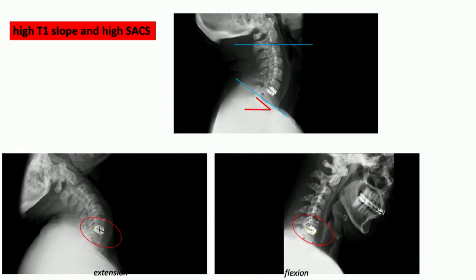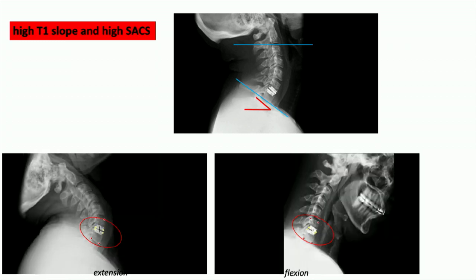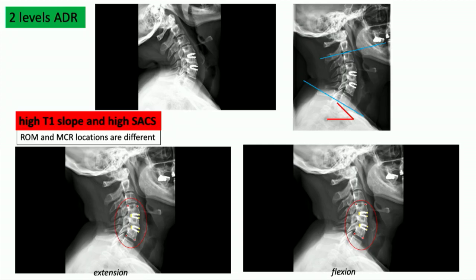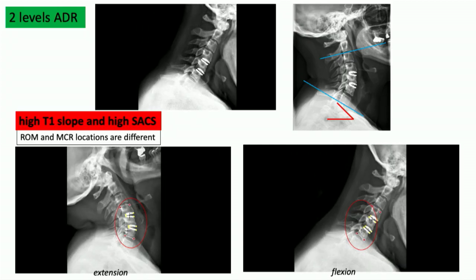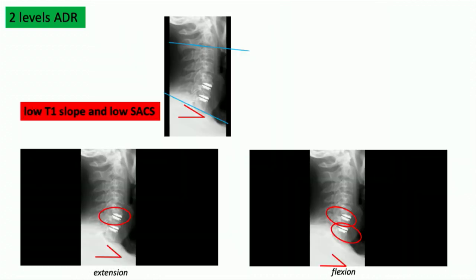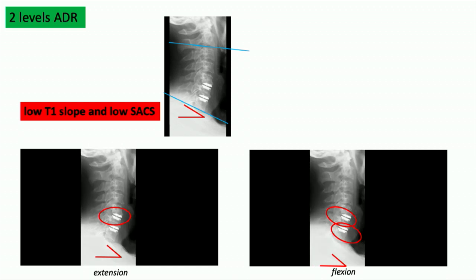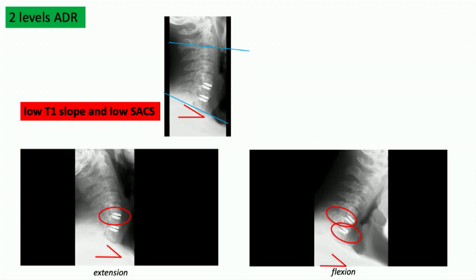Again, another case, you see those patients very often have a tendency to have a kyphotic neutral position with mechanical prosthesis. It's the same with two-level prosthesis. We can have the same thinking. Look at this again, with this type of adaptation between the neutral position, hyperextension, and hyperflexion.